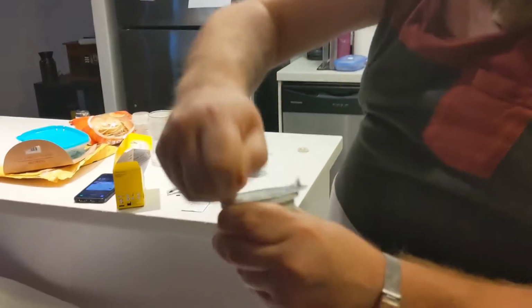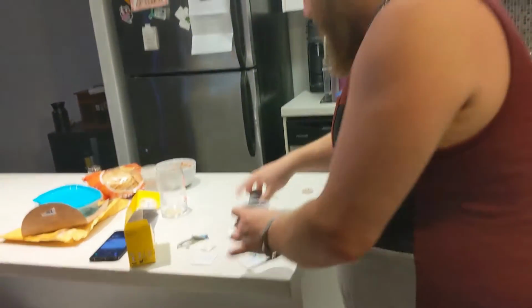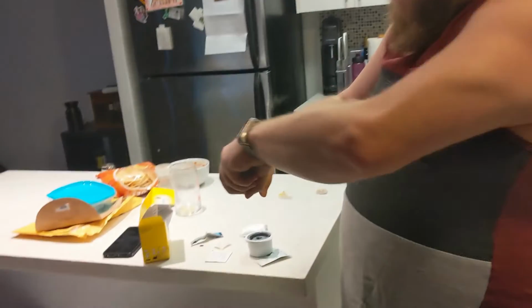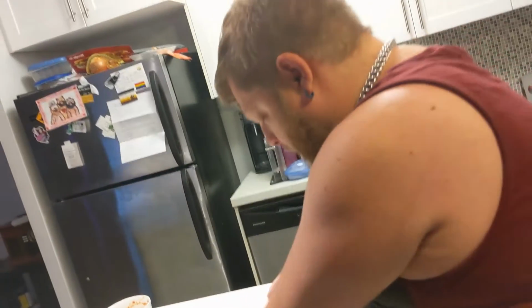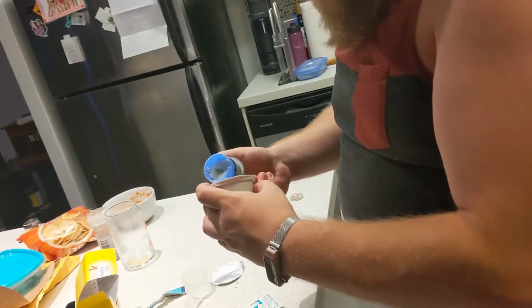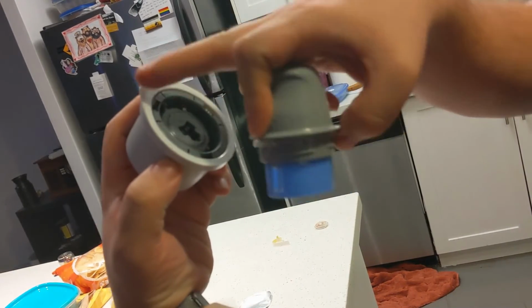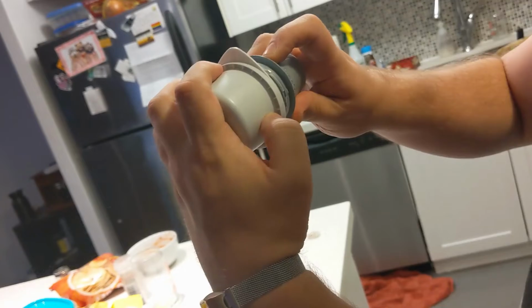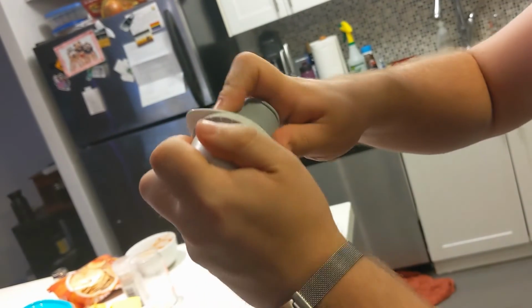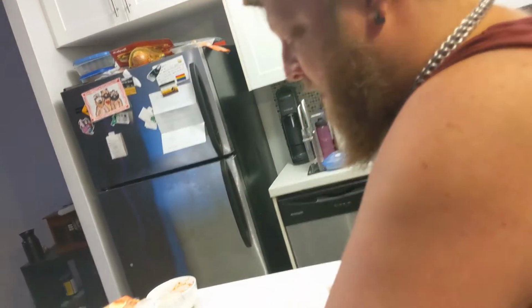So you take the thing off the top. That's the technical term, the thing. Definitely a scientific term. This comes off. So this is going to be the injector. So you just have to line up this lip with this line. And once it lines up, as you can see, the sensor is now loaded. So we're gonna leave that for a second because he's now gonna use the skin tack on me.